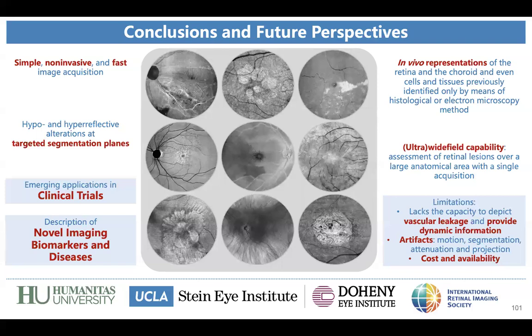But as with any other imaging modality in the retina, it won't be the standalone technique. I don't know if you agree with me. I don't know a standalone technique for evaluating any retinal disease and grading and making us take the right choice for treatment.